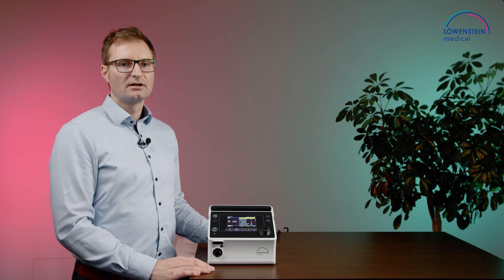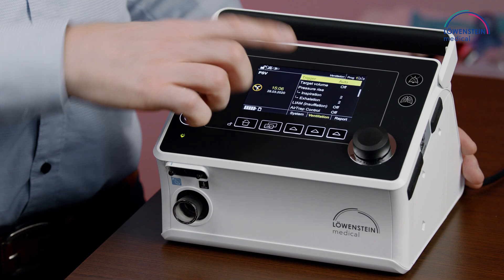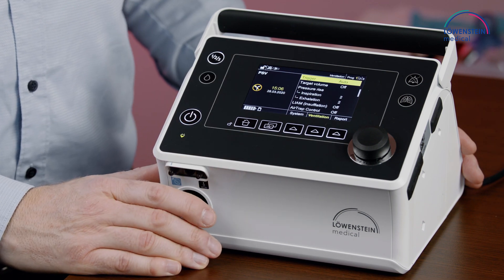The trigger settings can be found in the ventilation menu as well. We have the possibility of an auto trigger. Auto trigger means the device will recognize missed trigger efforts and adjust the trigger step to a more sensitive step.